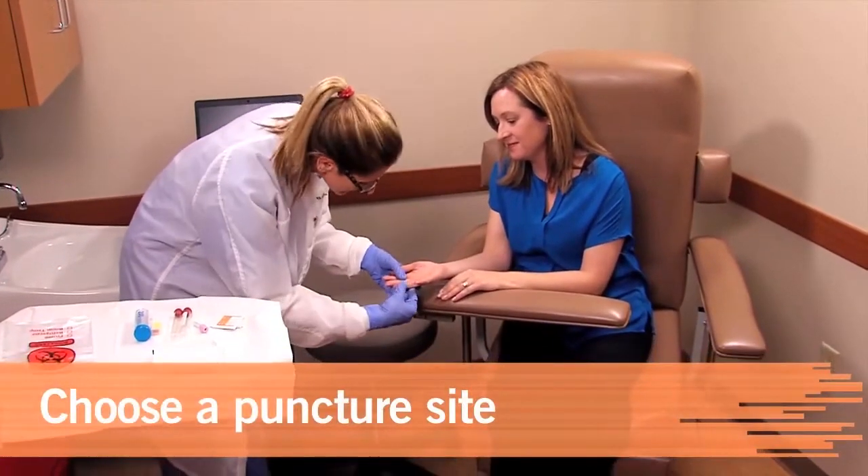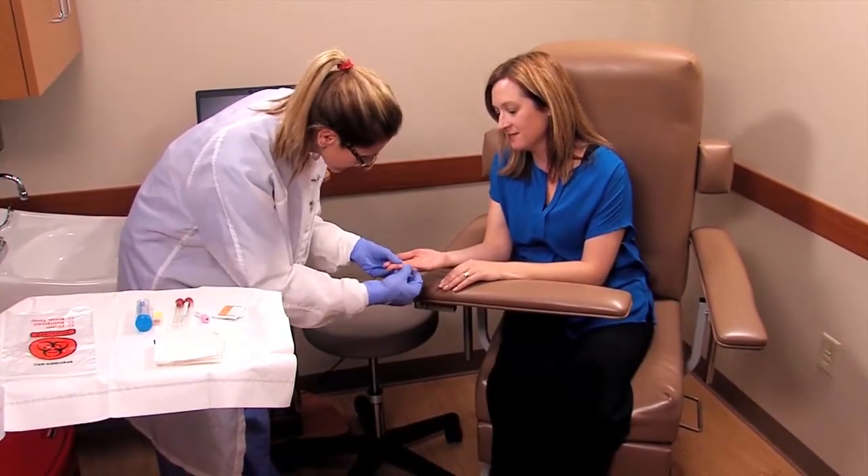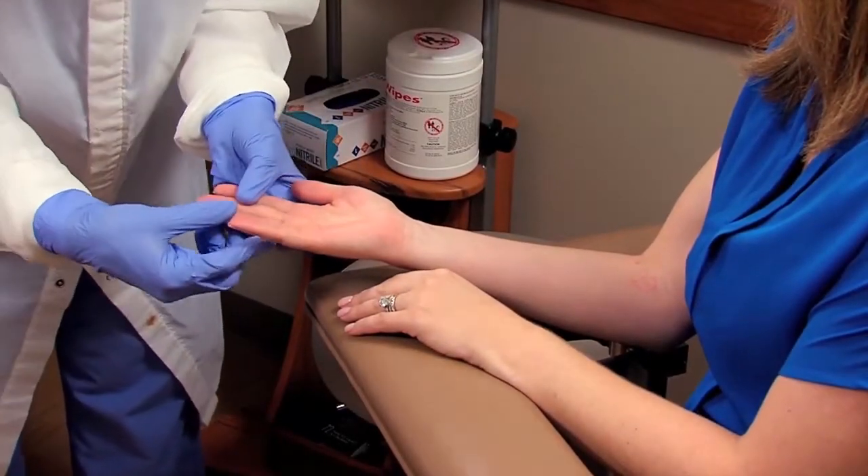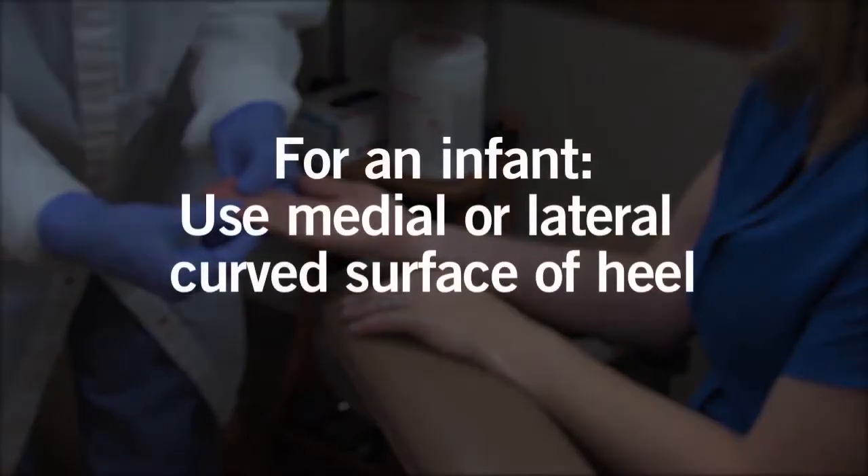For an adult, the distal portion of the middle or ring finger of the non-dominant hand is often used because that hand may have fewer calluses. For an infant, the medial or lateral curved surface of the heel can be used.